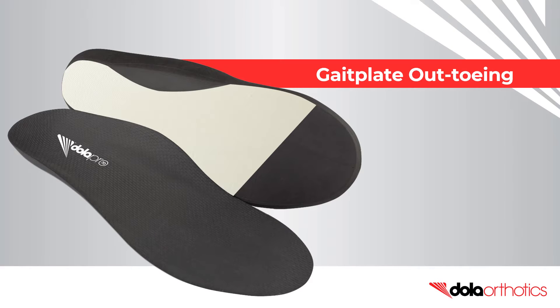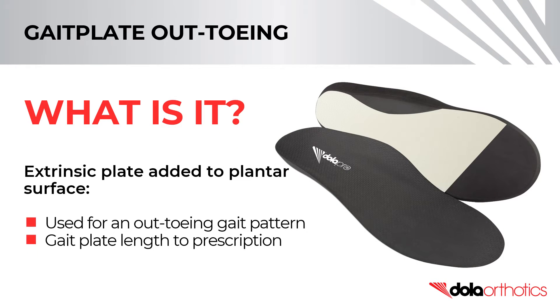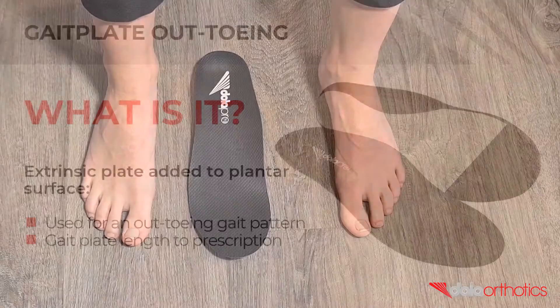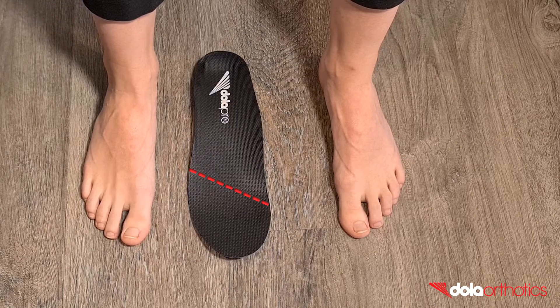How to modify a full-length Dola Pro orthotic with an out-toeing gait plate. An out-toeing gait plate can be used to address an out-toeing gait pattern. In this video, we will show you how to complete an out-toeing gait plate on a full-length Dola Pro orthotic.